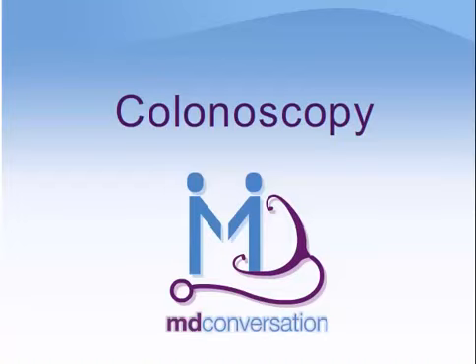Welcome to MD Conversation. This module discusses an overview of a procedure called colonoscopy.